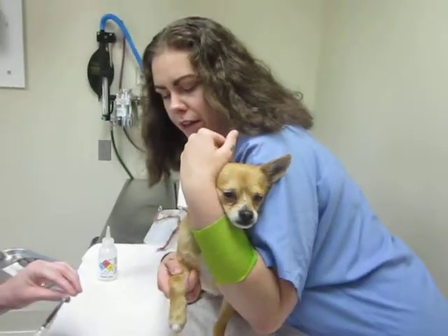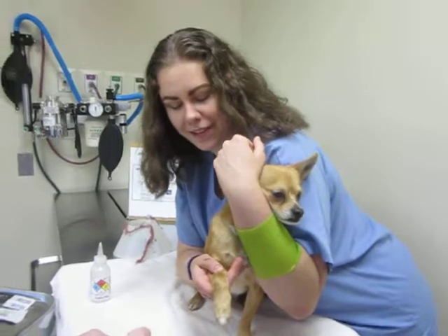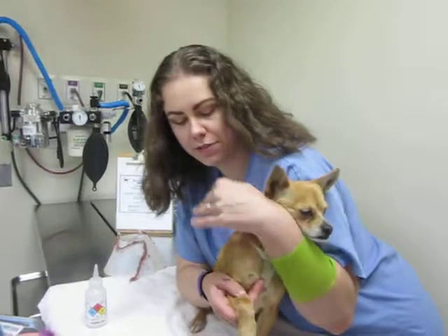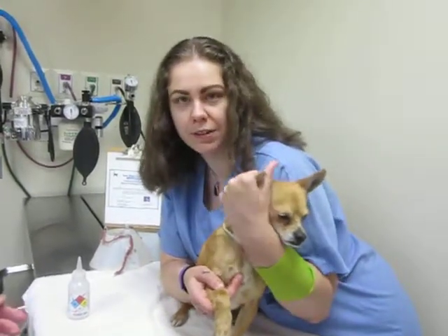I'll just hold it off. I've let up on my tourniquet that I used with my own hand so that we don't cause a hematoma. And I'll just hold pressure on that for another minute or so so we don't do any bleeding under the skin.